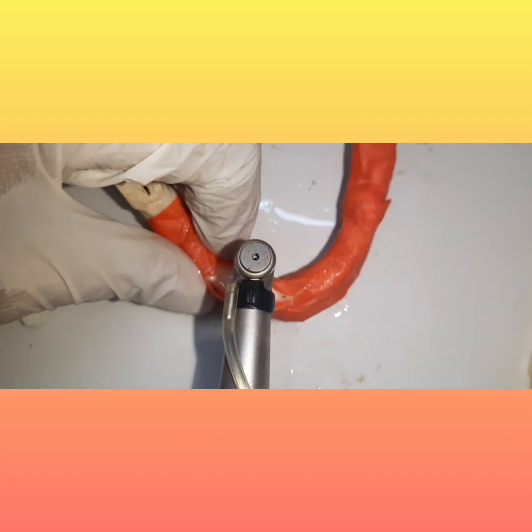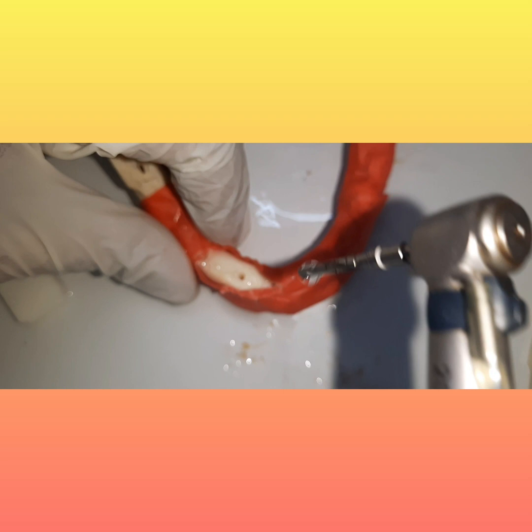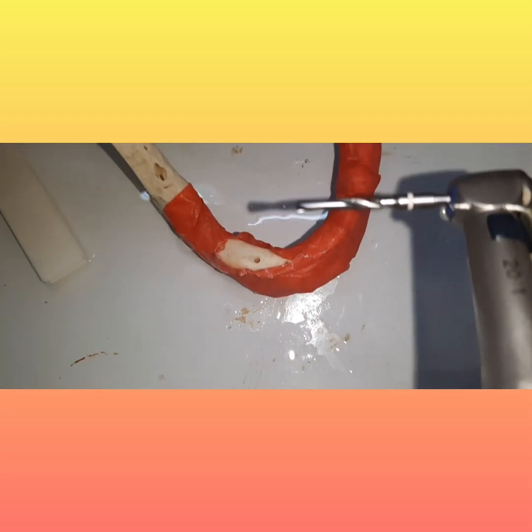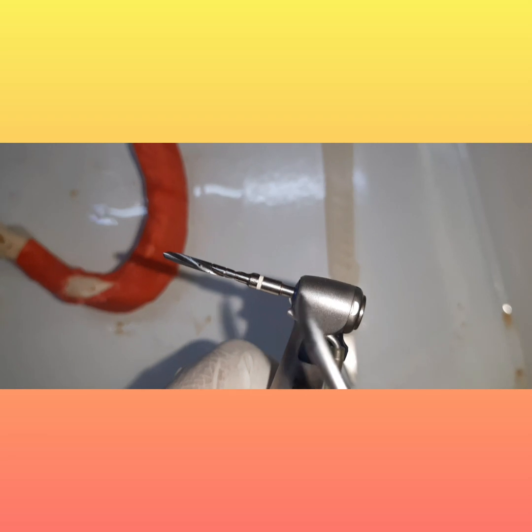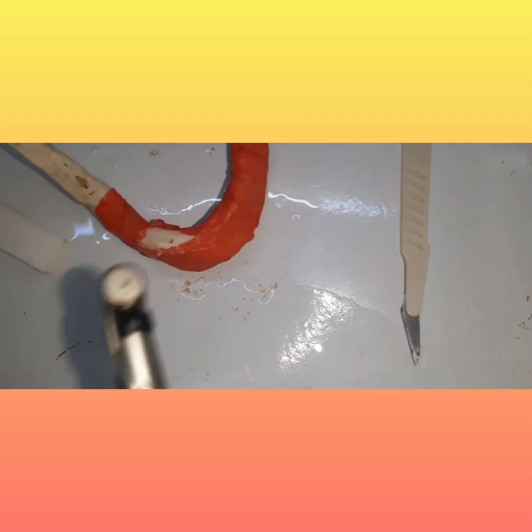And till 10 millimeters, and you have to stop. So how will you decide it is till 10 millimeters? You can see these, there are linings, if you can focus it there. So these linings are there. So these are of specific lengths. So accordingly, whatever you have planned, you will stop there. So this is 10 millimeters. So we have taken a drill till 10 millimeters. We can just see it again. So our drill is going till 10 millimeters.